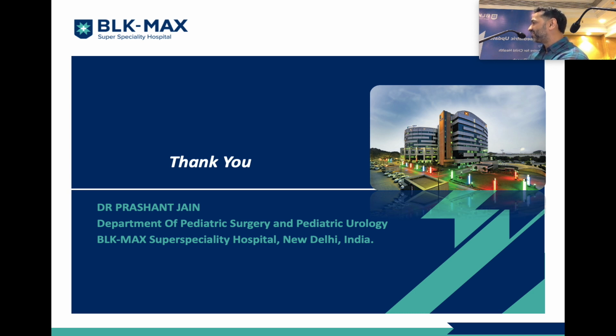If this much radiology everybody were to learn, I don't think there is a job for us to do much more here. Anywhere in the pediatric age group, I think we should be very conscious of the radiation that we give. Most of the time, in fact 95% of the time, the X-ray, as he said, abdominal erect and supine, in case required decubitus, and a chest X-ray, added with an ultrasound, should provide you most of the time the diagnosis that the child is presenting with.